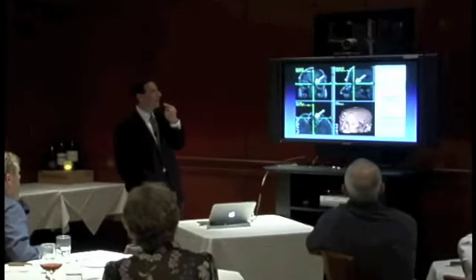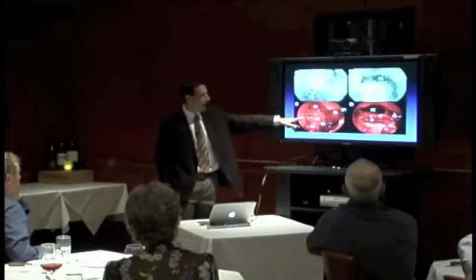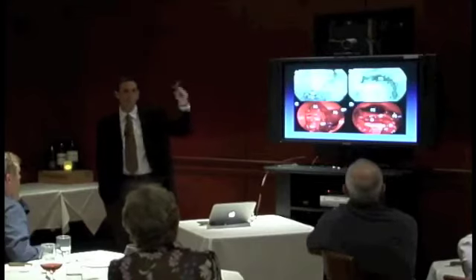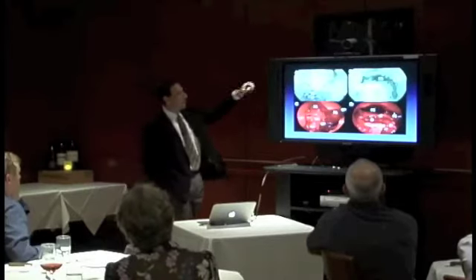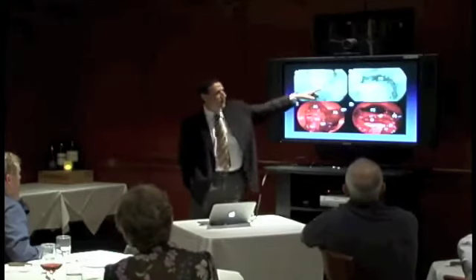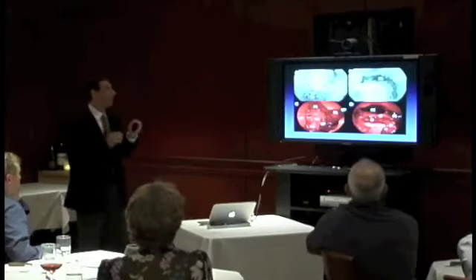Here we have the image guidance identifying where the lesion was located. Here's the actual tumor when we found it. On the top are cadaver dissections showing the exact same anatomy. So right here is the cribriform plate. This on either side is what's called lamina papyracea, so that's the medial wall of the orbits, the eyes.